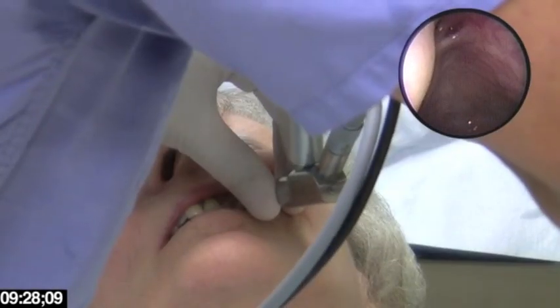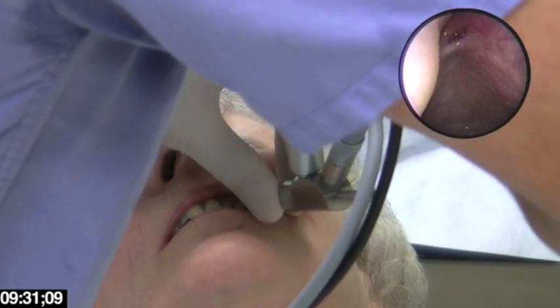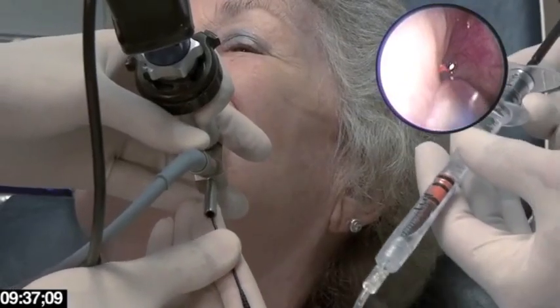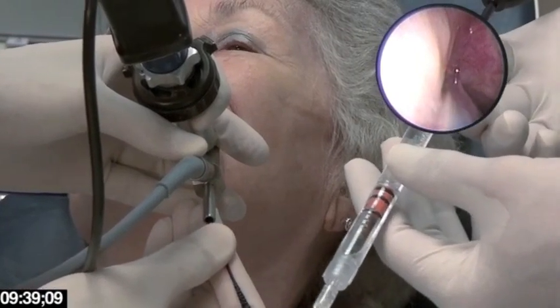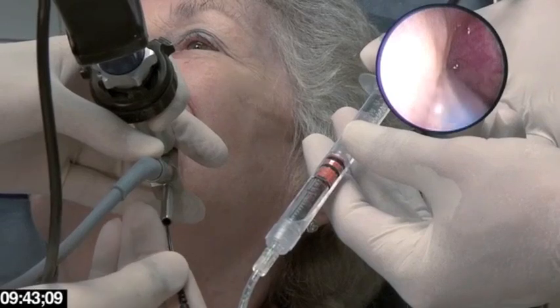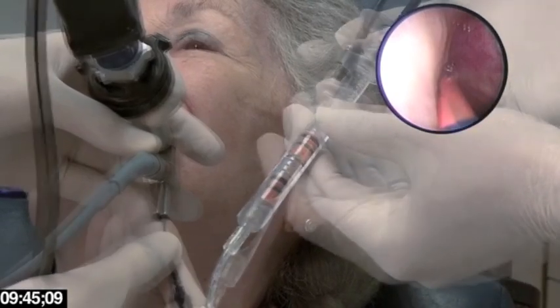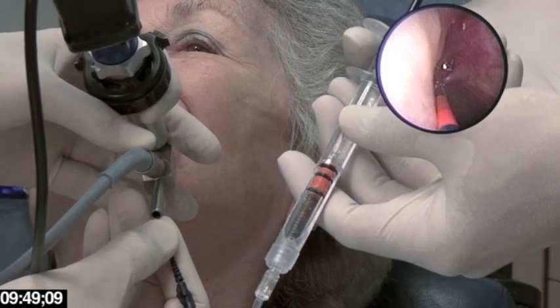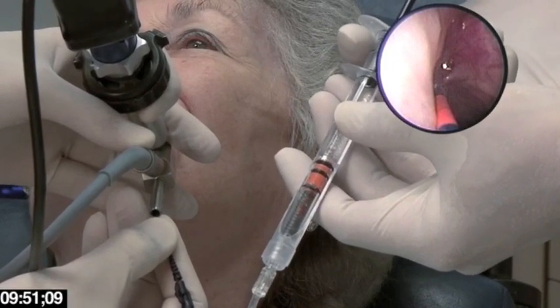With a little bit of angulation, I have a nice view of the opening to the sinus. Feeling my way into the opening and we are in. Now we're going to inflate — you'll hear sort of a rice crispy type sound in your sinus. Inflating.